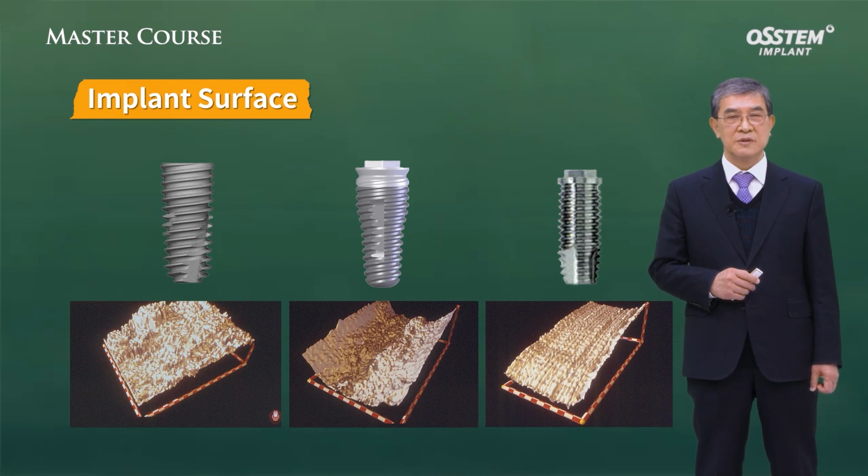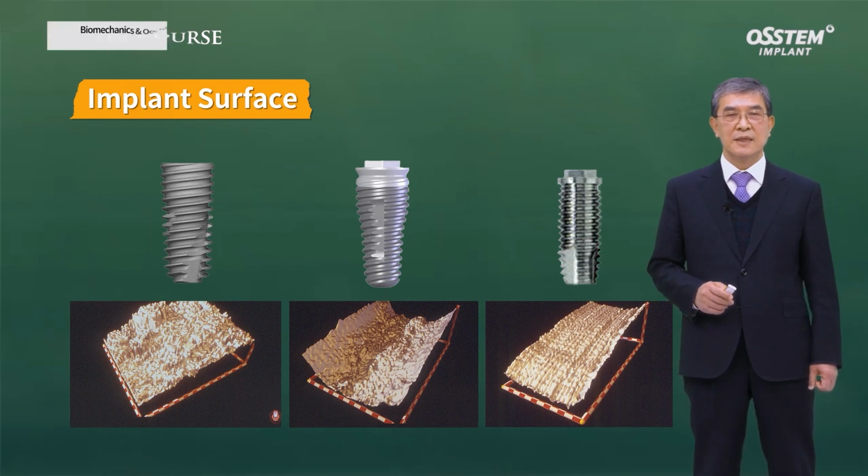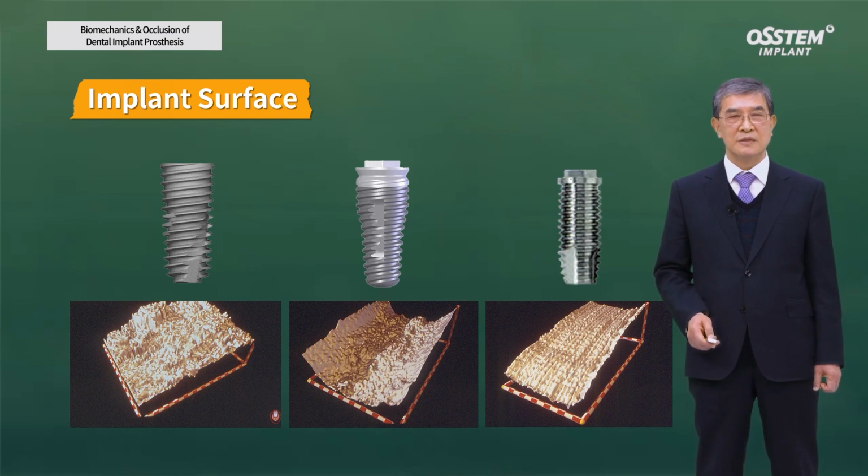Appropriate rough surface is right. It shouldn't be too rough or too smooth. When we talk of roughness, we talk about Ra and Sa. The surface should have about an Sa of 1.5 to 2.0.